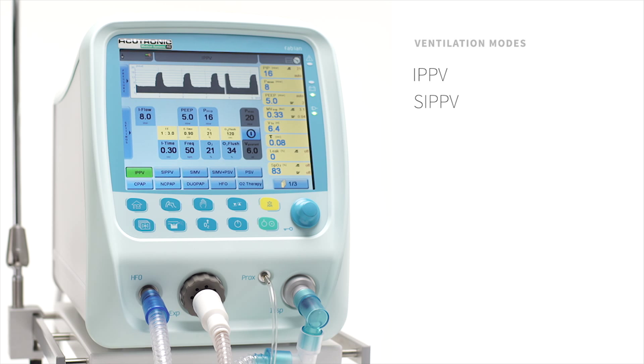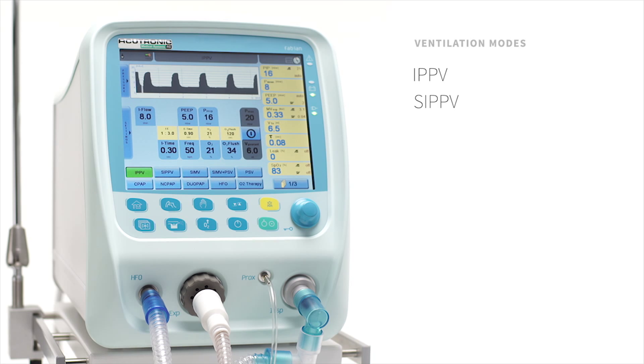SIPPV, Synchronized Positive Pressure Ventilation, same as assist, assist control, or PTV.